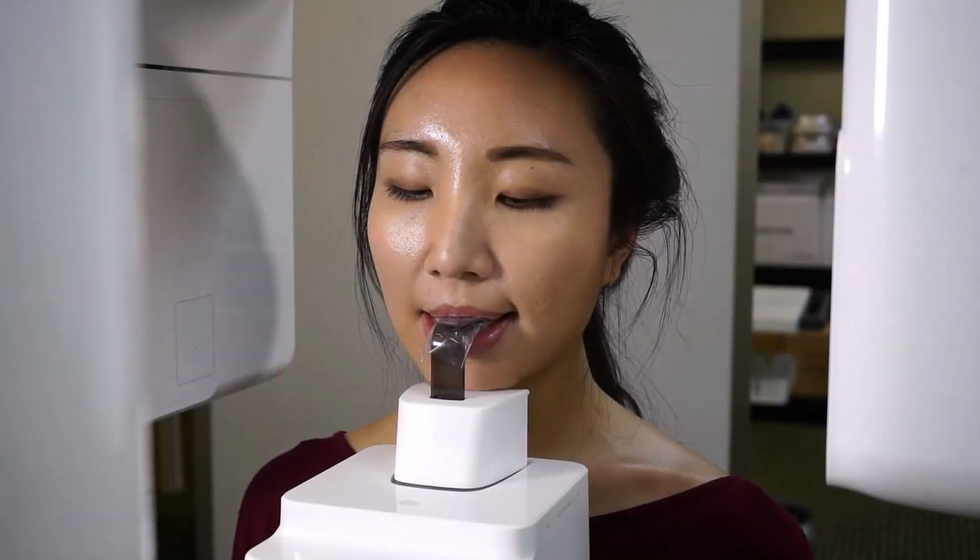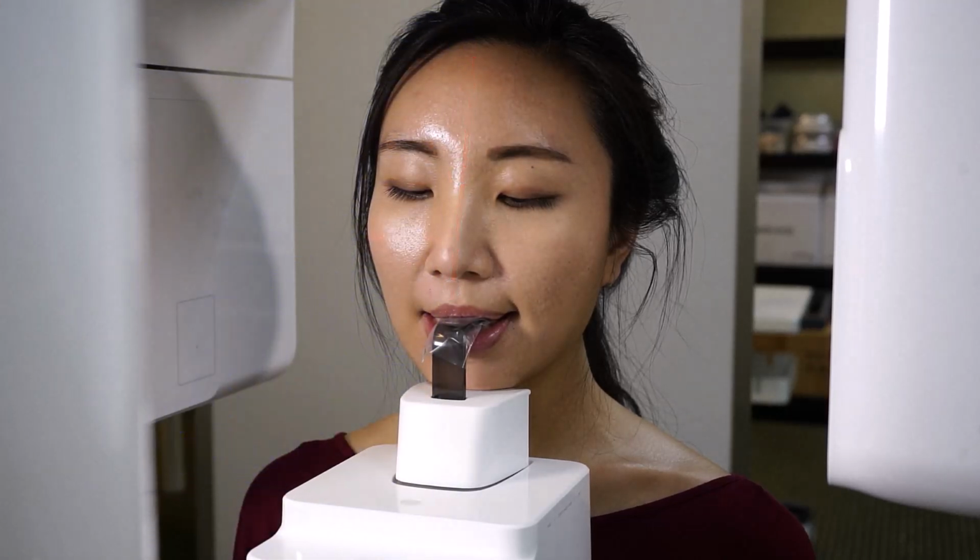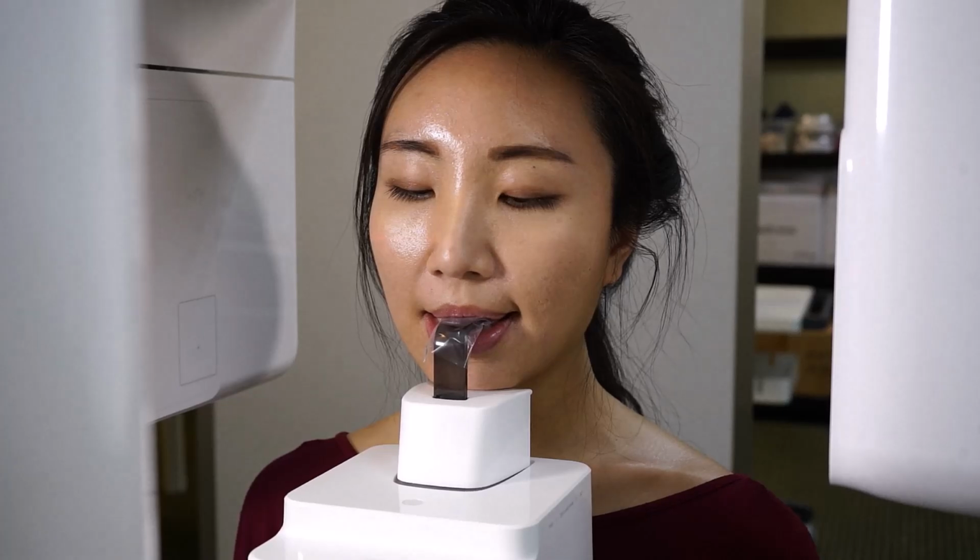Next, we focus on the mid-sagittal light and focus on getting that line through two anatomical points on the patient's head. One in the center of the eyes and the other at the philtrum area so that the line is right through the center of the head. To adjust the position, move or tilt the patient's head to conform to the line. The A9 has a mirror attached to the vertical frame for both the operator and the patient to ensure they are centered and positioned properly in the device.